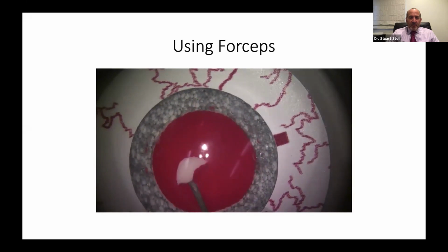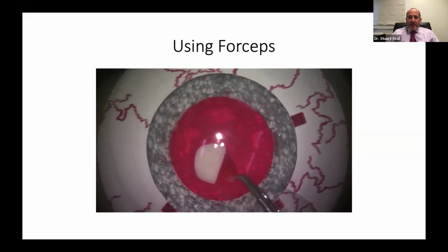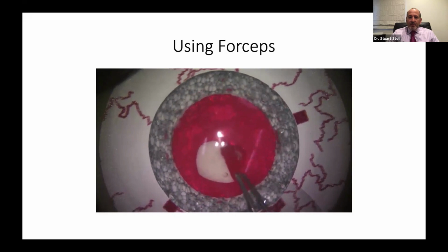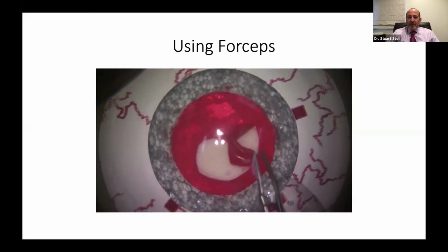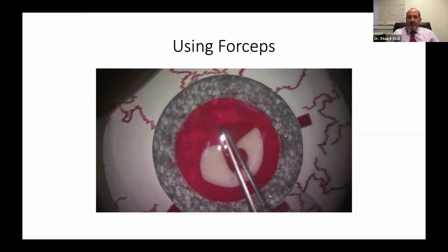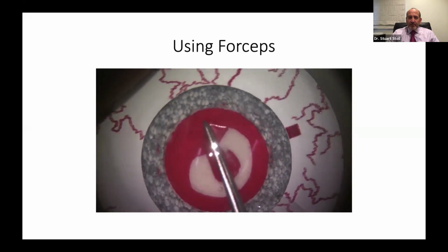We're going to start here, initiating with the forceps, and then we leave a nice flap there, grab it, pull down. Now we're on the 6 o'clock position. Leave the capsule in an optimal place, re-grasp it, tips are out to the side, following around, and that's using the forceps. There's fantastic control. We can reposition the capsule when we need to, and then continue on. There we go. Look at how we're leaving the capsule and then continuing on.